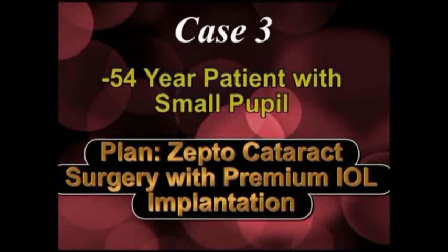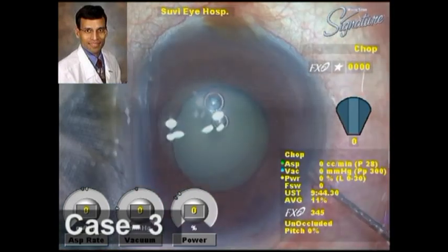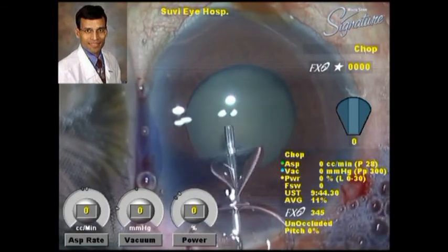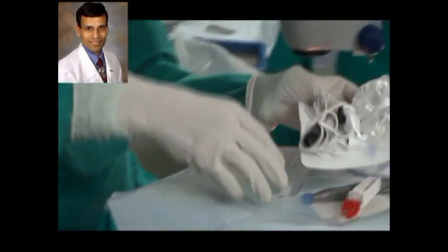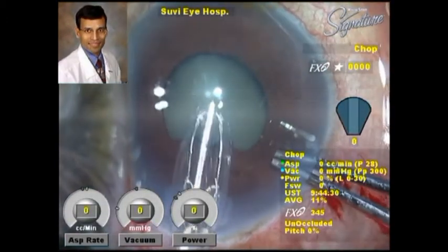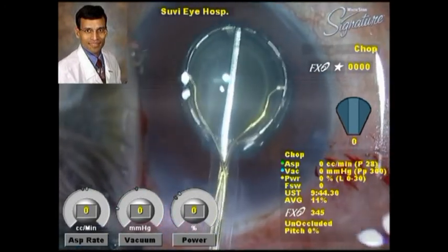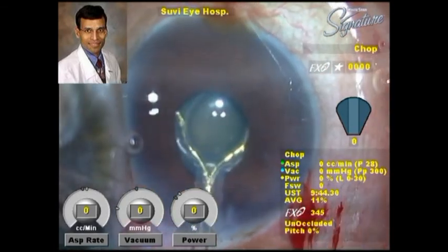The third case is a 54-year-old patient with a small pupil, and the plan is to perform Zepto cataract surgery with another premium IOL implantation. As we can see, the pupil is not well dilated. The advantage with this device is that the suction cup is fairly flexible and can actually be placed under the pupillary edge to achieve a good-sized capsulorrhexis even in cases of small pupils. The handpiece has been primed, placed inside the anterior chamber in a retracted position, then opened up and placed under the pupillary margin, and the nano pulse energy is delivered.